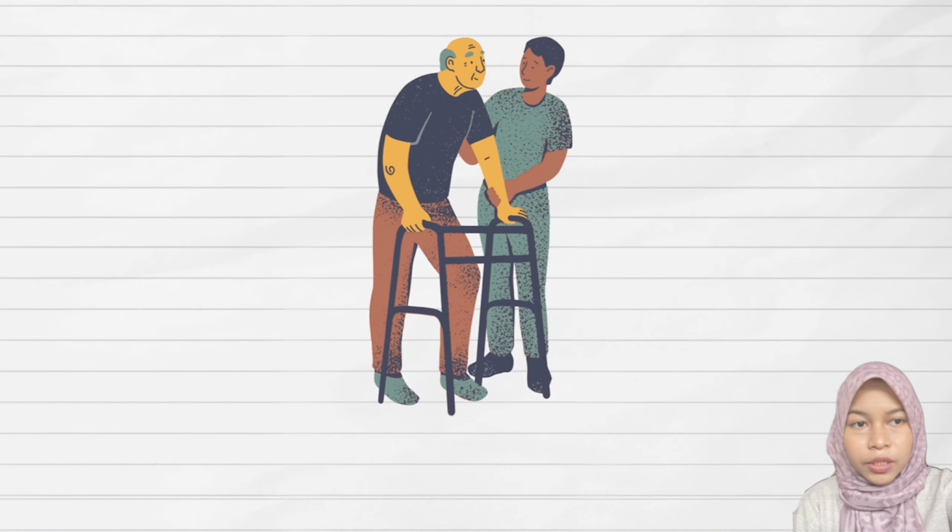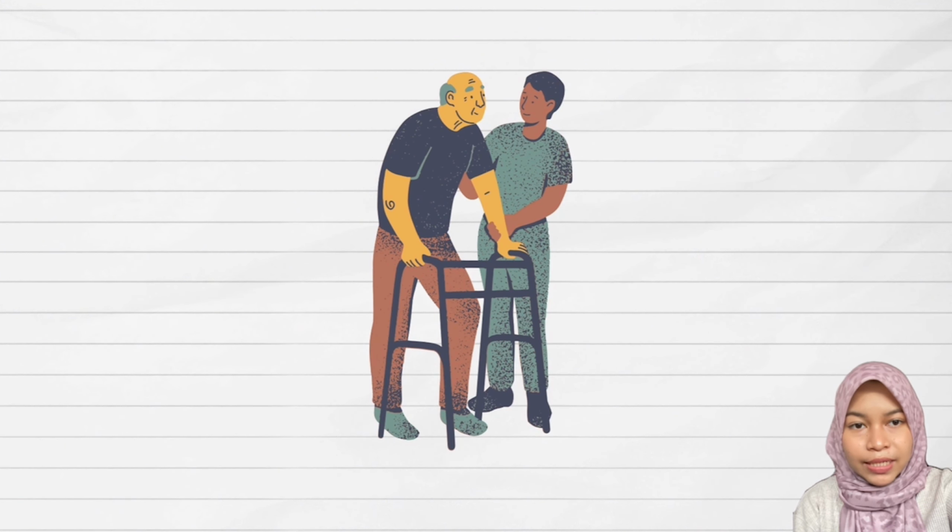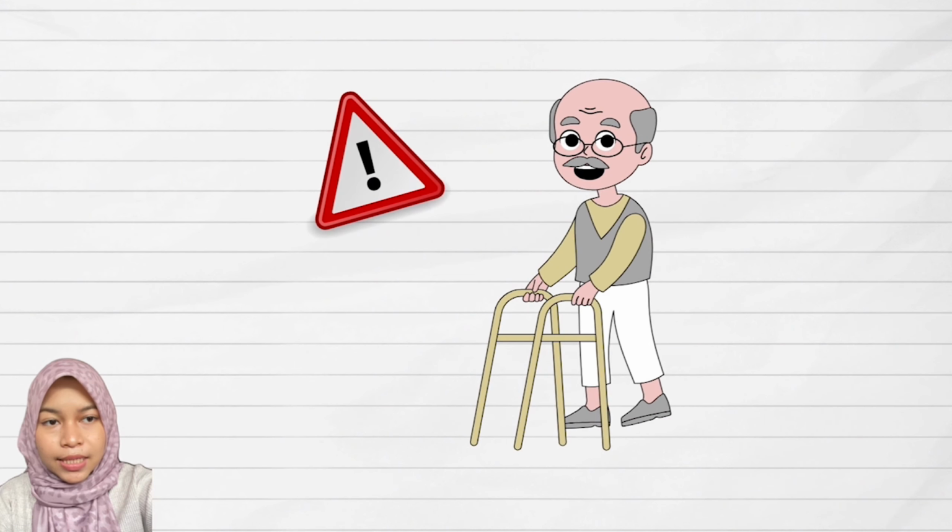Walking frames are a solution to mitigate the risk. These devices are more than just aids. They help with improving balance and stability. Why is it crucial? With the high incidence and severe consequences of falls, walking frames become instrumental in reducing risk, ensuring the safety and preserving the independence of elder adults.